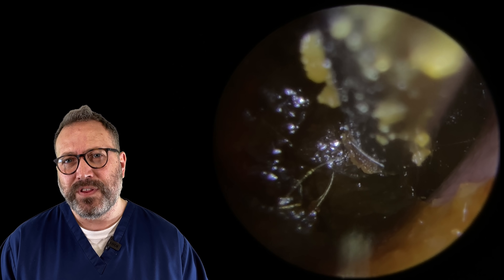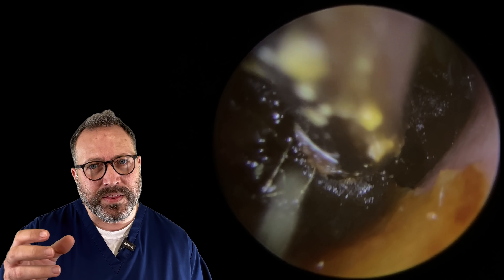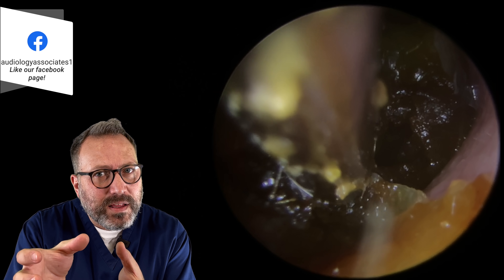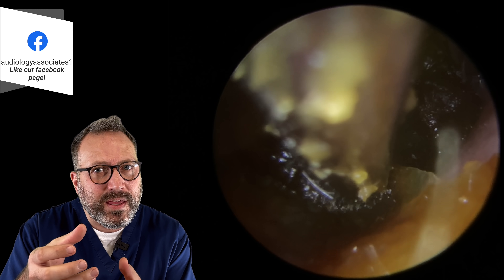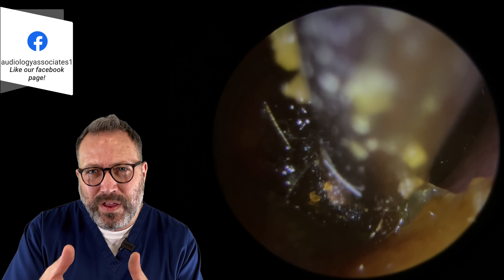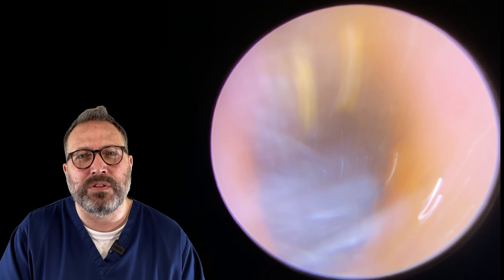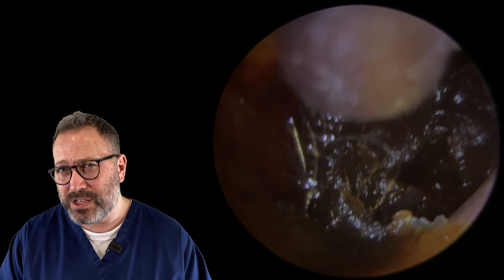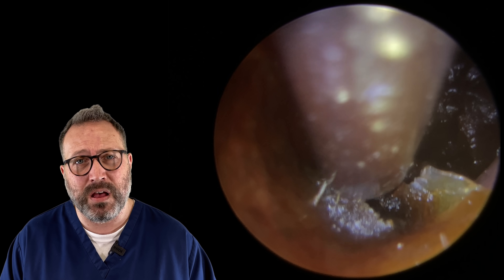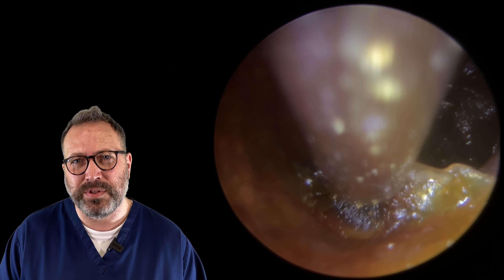We're going to aim for that left side where we've just started to finish the last peel. You can see at the bottom right corner it's just coming away. We've popped a little bit more oil in here, and we've turned the exposure up on the endoscope as well just to give us a slightly clearer view because it's so dark in there. It does make the video a little bit juddery sometimes when you pop the exposure up.